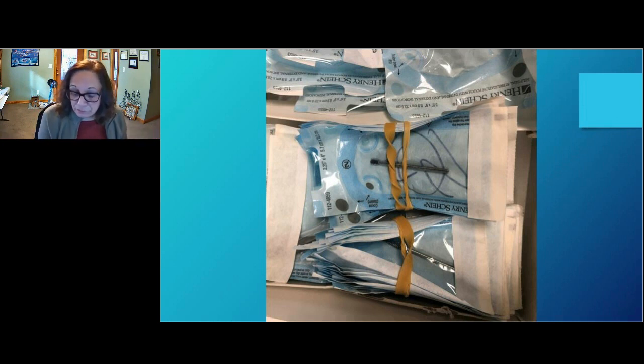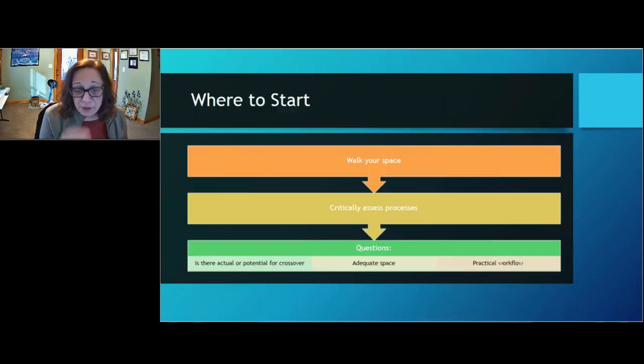But I definitely would not. None of these burrs are considered to be sterile now because they've been compressed. That plus, who knows how much pressure is being put on the sides here with those rubber bands. You don't know if it might have small tears in it.